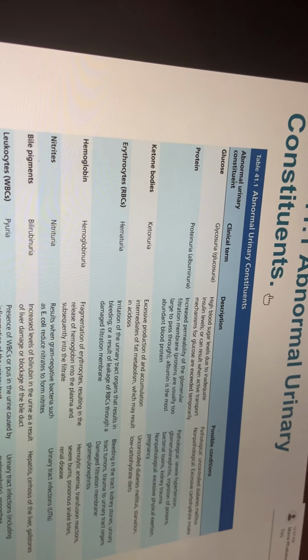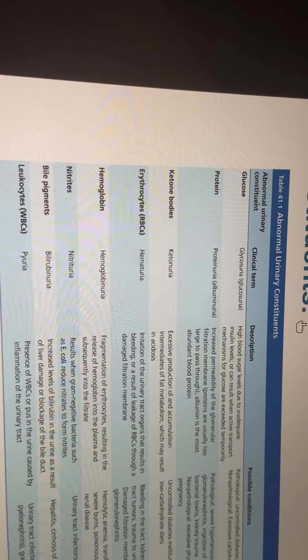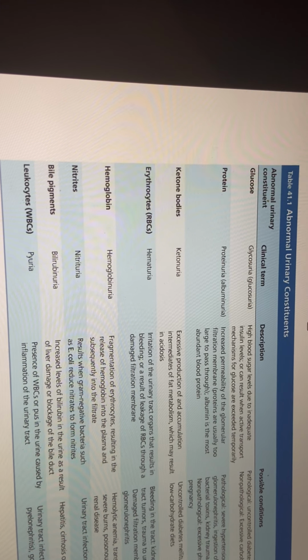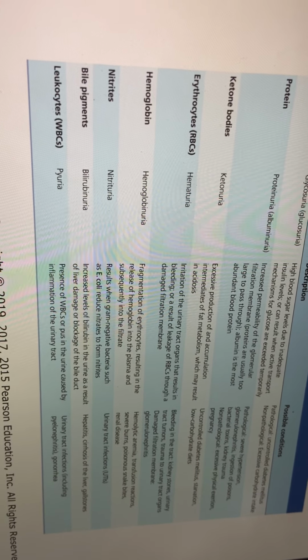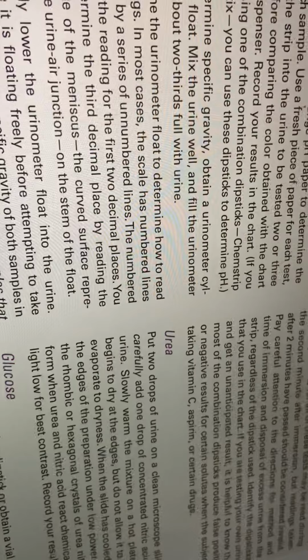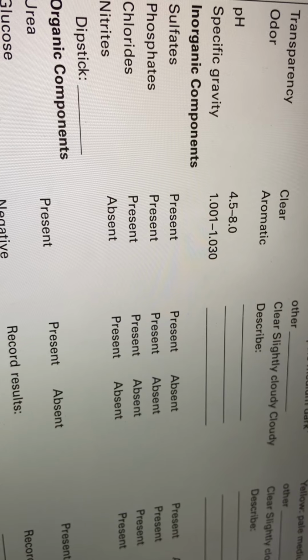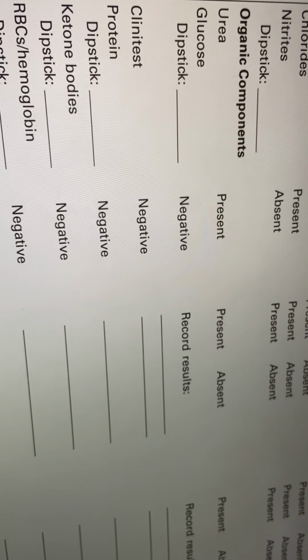That's also hematuria. So hematuria has two types, okay? Fresh hematuria or dark hematuria. So in the diabetes, there is no change in color. You can say clear or slightly cloudy, because glucose will not give a cloudy. Put sugar in your water, it will not make it cloudy. Maybe it's slightly cloudy. Okay. Now in the glomerulonephritis, the color is dark.